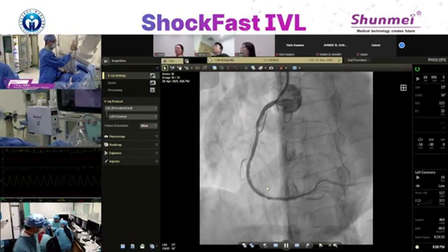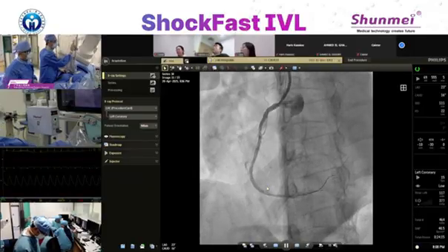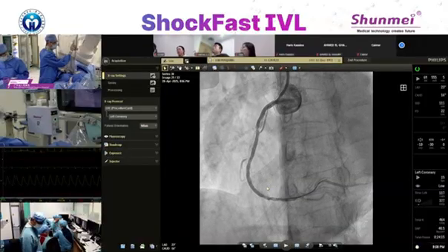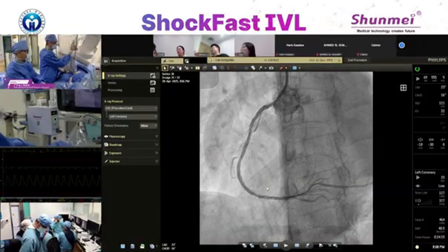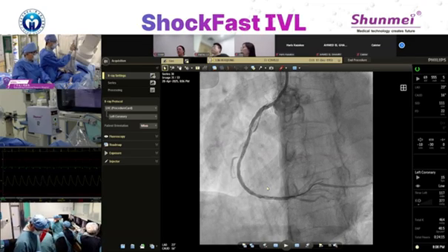For the distal one, I'll avoid the bifurcations.